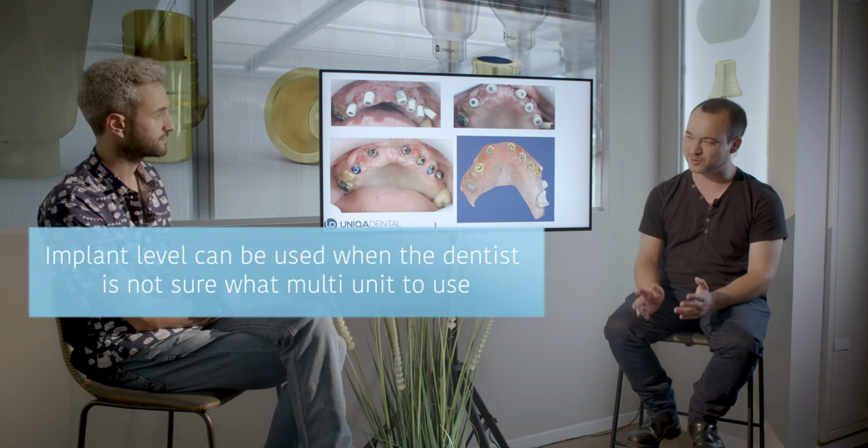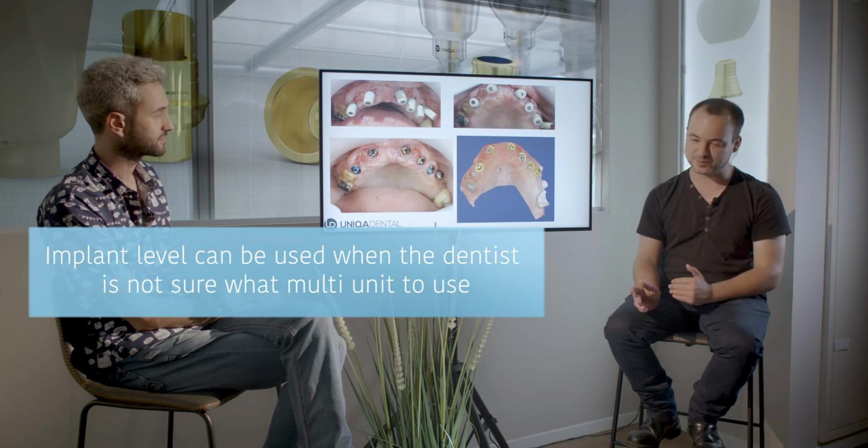If you use implant level scan abutment, on the one hand it's great because you can choose from all of the options, all types of multi-units. You can choose all the straight ones, you can choose all the angulated ones, you can change between them. But here, the most crucial part is how you transfer this information from the technician back to the doctor, because sometimes the technician doesn't tell the doctor exactly what type of multi-unit he used.